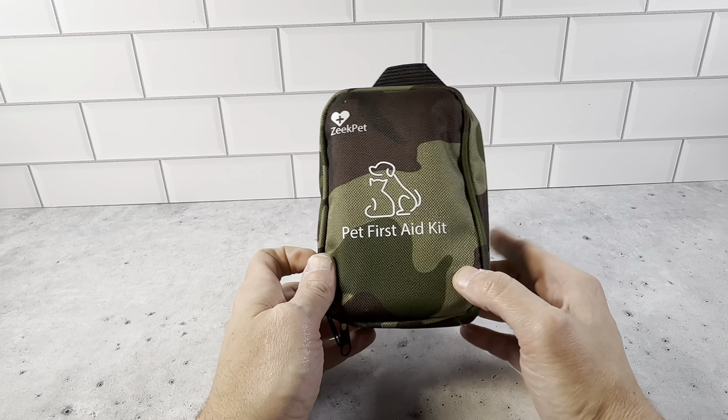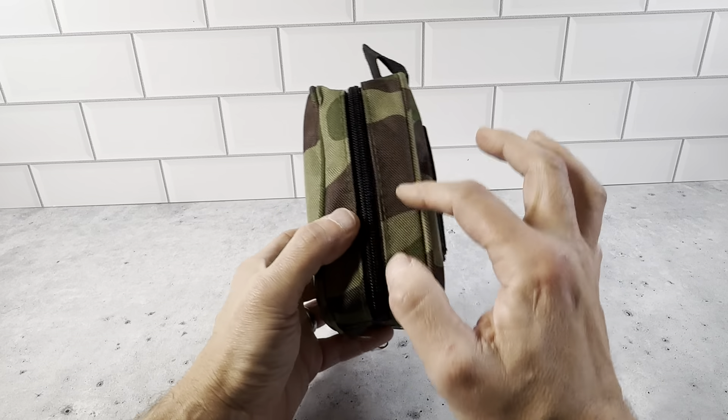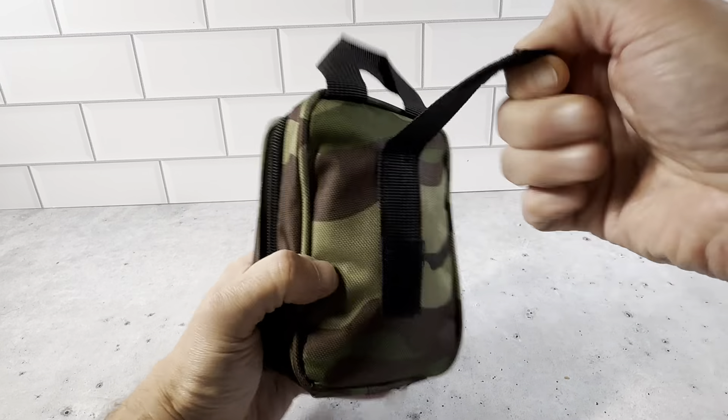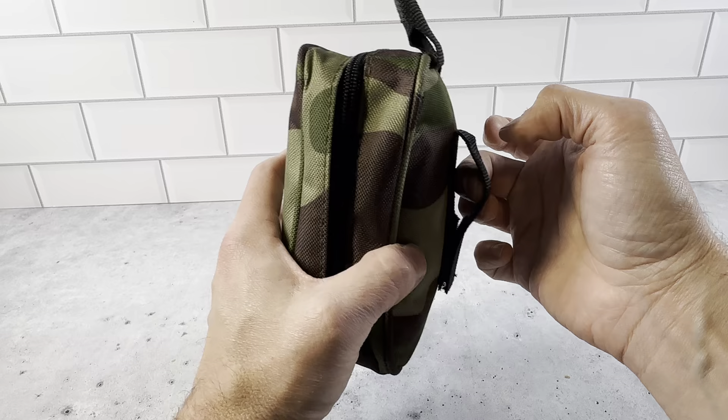The Zeke Pet First Aid Kit, for cats or dogs. It's a really nice kit. It's about six inches tall and maybe a little over three inches wide. It's got a handle right here and it's got Velcro here where if you're going to Velcro it onto something, it could strap on something right here.